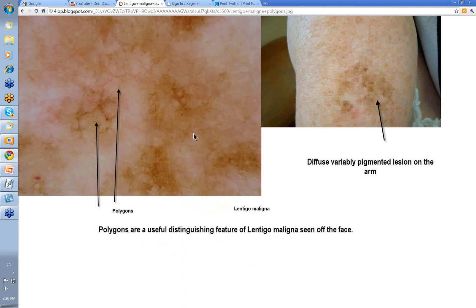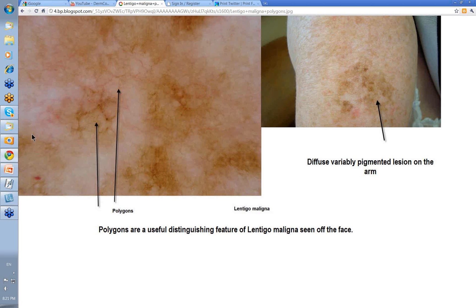Off the face, there's another structure you should be able to recognize. This was the lesion clinically — diffuse pigmentation with little areas of accentuation. Looking with the dermatoscope, it's difficult to say that's lentigo maligna. But if you see these structures called polygons — go back and look at the video at the beginning of this series — then if you see these on extra-facial pigmented lesions, it's very suggestive of lentiginous melanoma or lentigo maligna. So, polygons: these multi-sided structures.